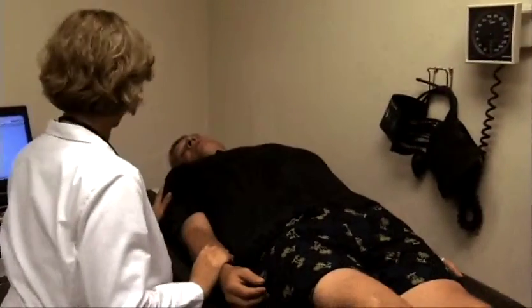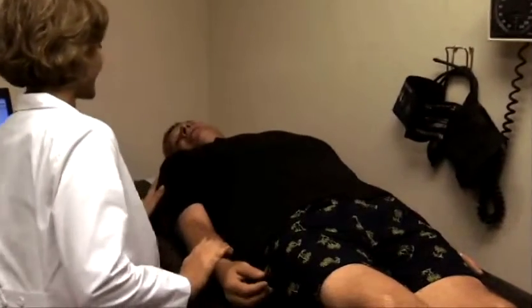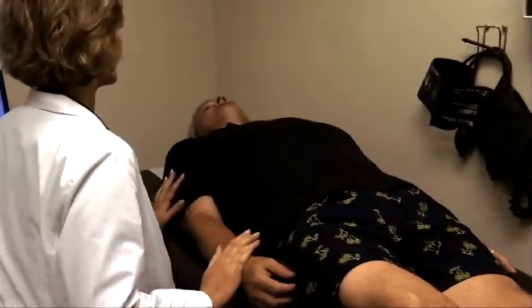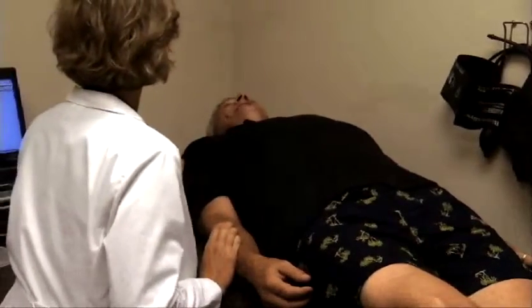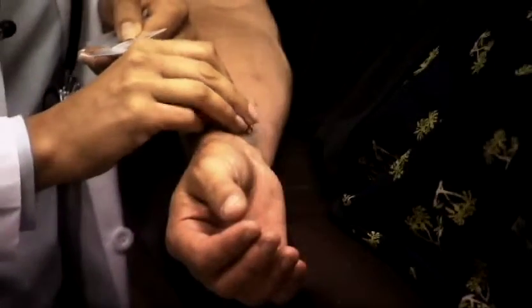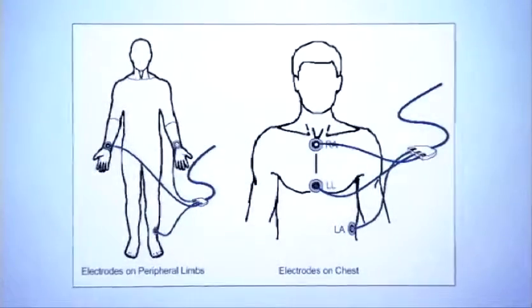Before beginning pulse wave velocity assessment, place the patient in a supine position and allow 5 minutes of rest. If you are measuring the carotid pulse, remove any pillows and make sure you will be able to tilt the subject's head back. Plug the blue ECG cable into the Cvms module. Apply fresh ECG pads onto the subject, using either of these configurations.